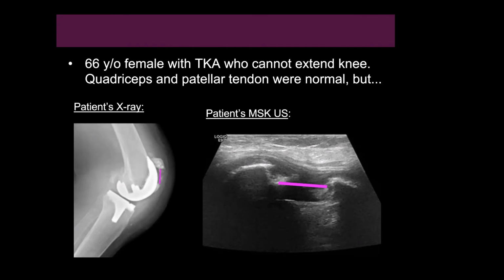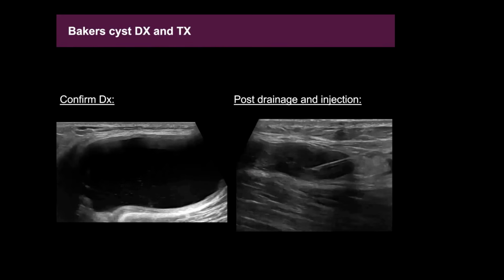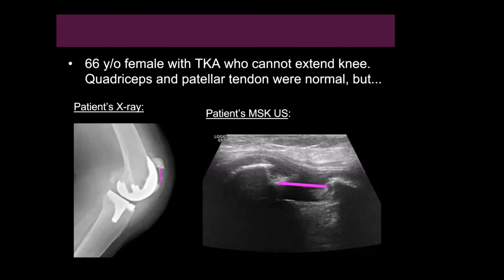But if everything looks normal, you could certainly use your clinical judgment to tailor your examination even further. And in this case, we were able to diagnose a fracture with ultrasound, which I thought was kind of cool. And do you have any tips when you're scanning to prove that out, like following the tendon down to the tibia to make sure that you're not seeing tib?